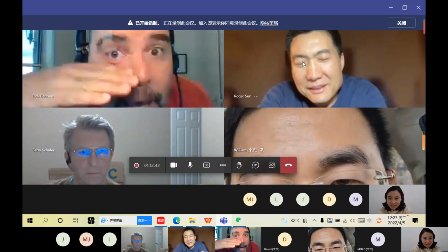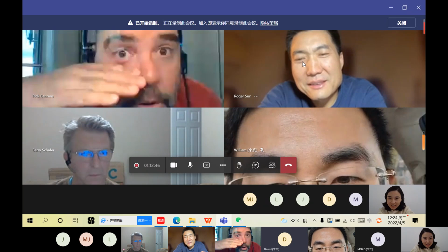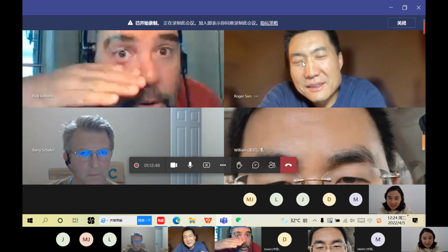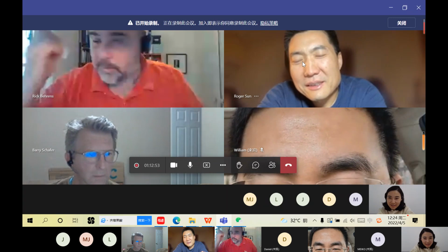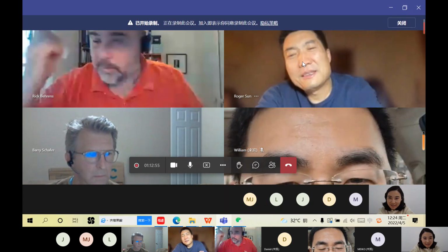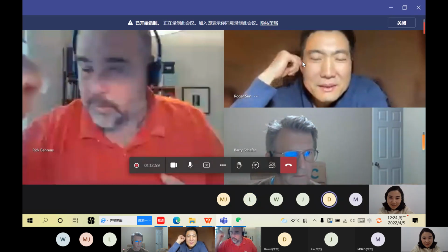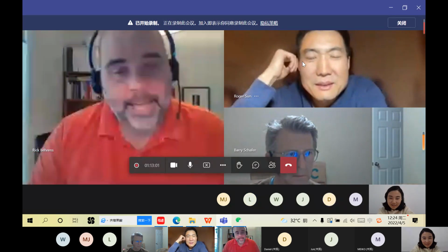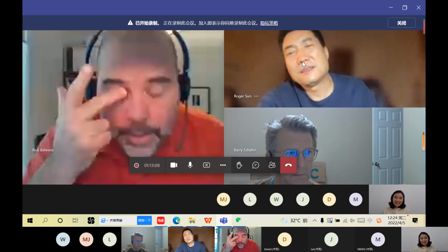And now it doesn't matter what your eye physiognomy is, it's going to be open. That's the best way to do it. So you don't tape the eyelashes, you tape on top of the eyelashes, and then you pull it off.